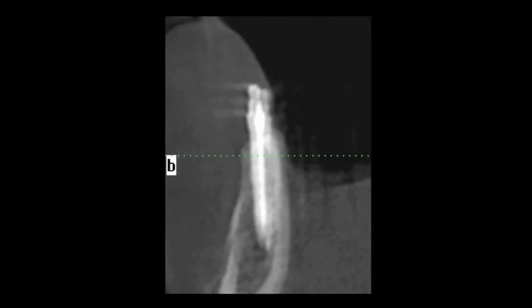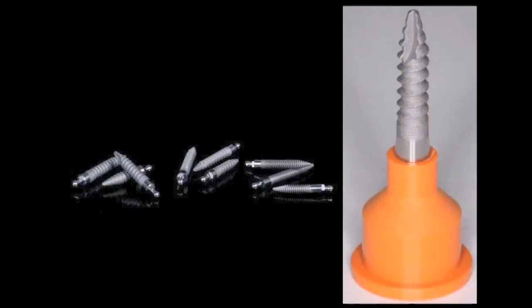Mini implants offer immediate loading. This is possible for two reasons. First, the mini-implant design is supported on both sides by cortical plates. Second, the auto-advancing design compresses and condenses the bone to help facilitate primary stability. These smaller implants provide a cost-effective solution to allow more patients to move forward with implant therapy by reducing the number of parts needed in the surgical and the laboratory phase.